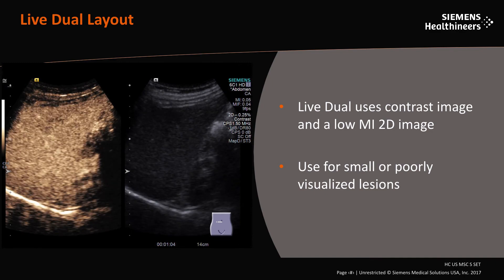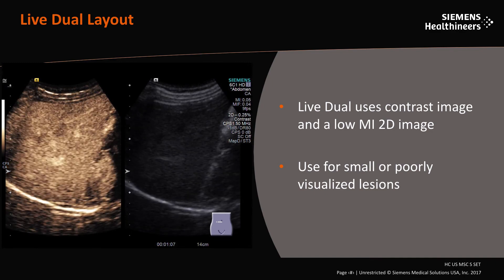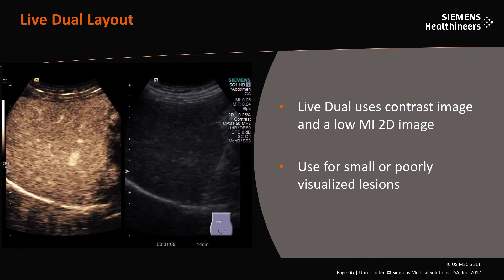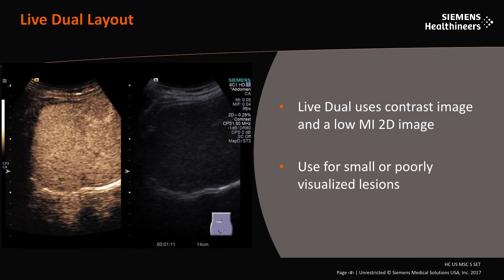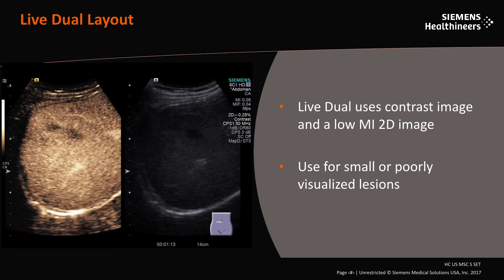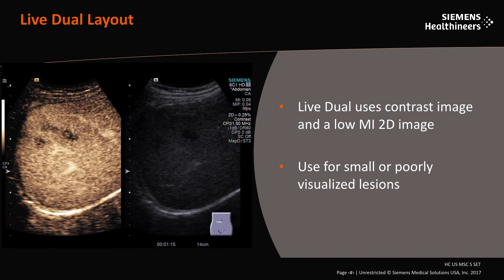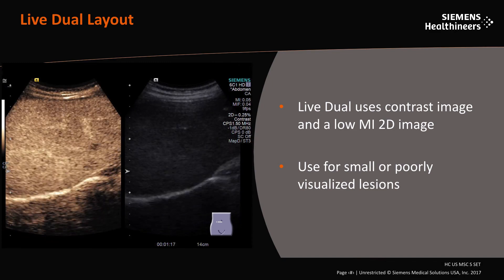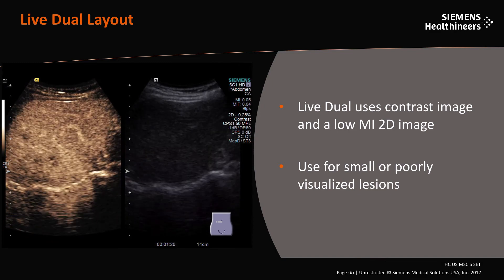In an example of live dual layout, note the position of the contrast image on the left and the 2D image on the right. The position of the contrast and 2D images are not customizable. Live dual is very important when imaging small or poorly visualized lesions.